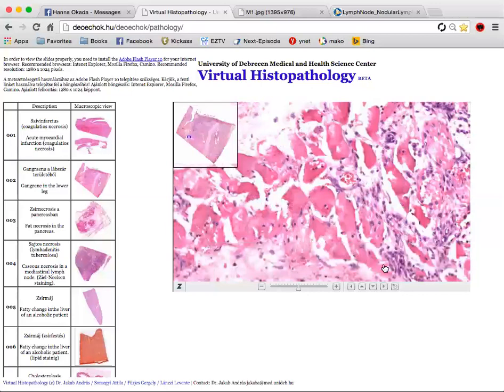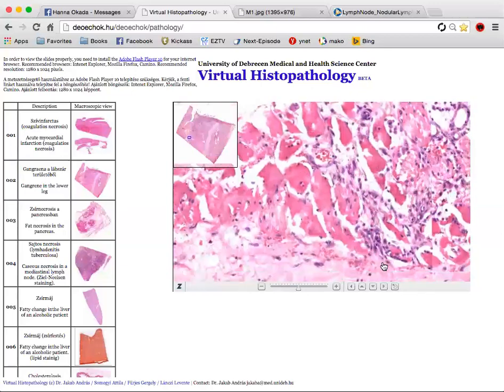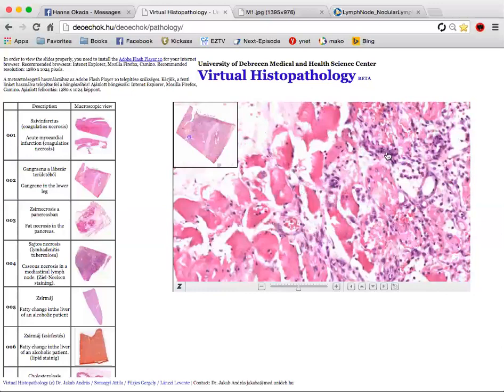The purple dots are the neutrophils, right? Yeah, exactly. The left portion of this picture is the necrotic region. It's all necrotic, even where the immune cells are. These are remnants of striated muscle cells, and these are just the neutrophils infiltrating here.